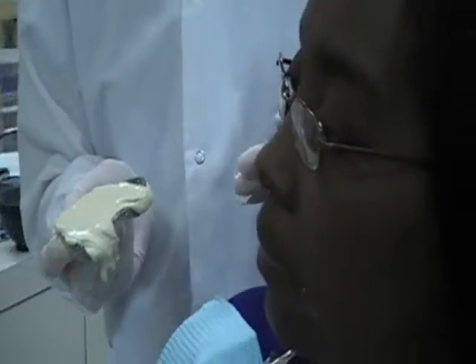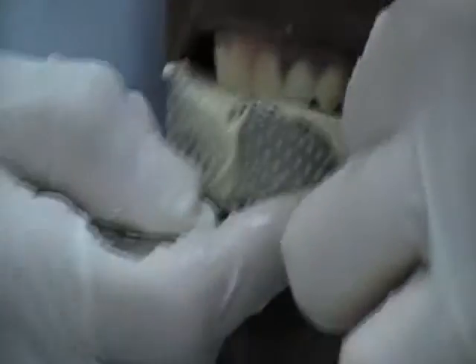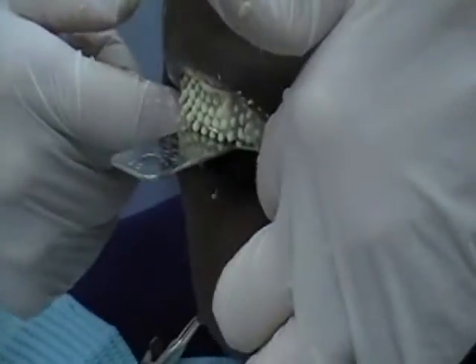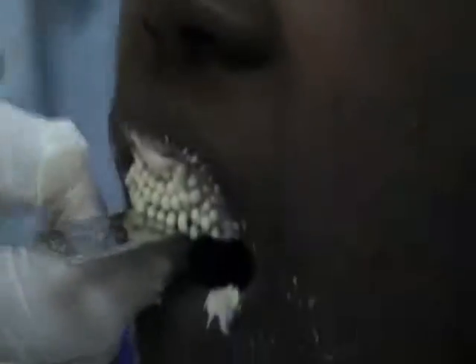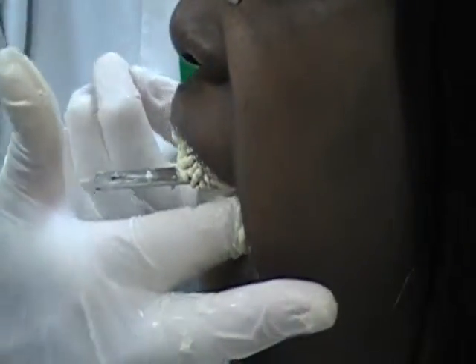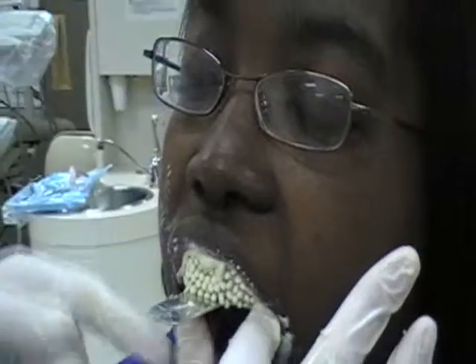Notice I'm coming from behind her — I'm starting in at the corner and then bringing it around. Back up and off the chair. I'm bringing her lips around and fully seating the tray. This arm of the tray should be parallel with the occlusal plane. You can look in the front and make sure that it is fully seated and parallel with the occlusal plane.